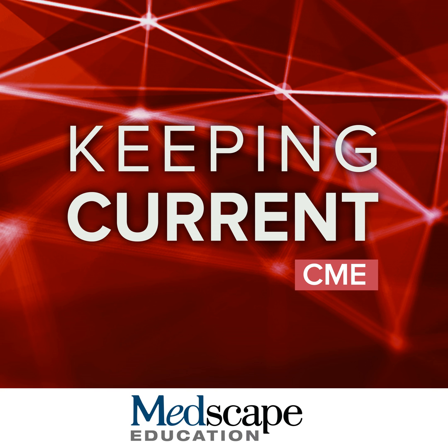We want this AD therapy enrollment exam to coincide with and be one and the same as our dementia brain MRI to prevent the need for repeat imaging. So we've therefore laid out our orders as that pretreatment enrollment MRI being an MR brain dementia with an indication AD therapy enrollment, and asymptomatic monitoring for ARIA is an MRI brain without IV contrast with the indication AD therapy monitoring. We want to distinguish these two very clearly as there's different relevant imaging findings for each of these scenarios.